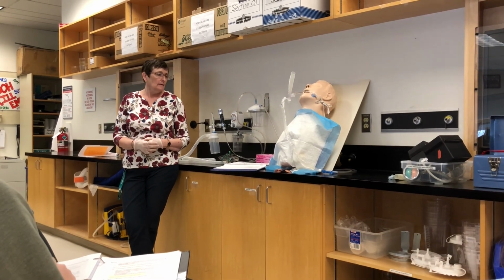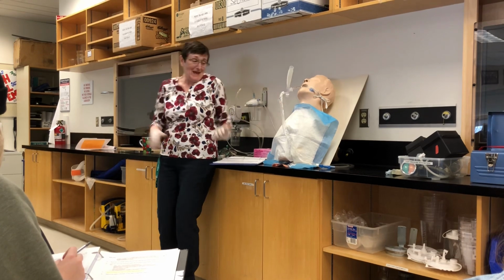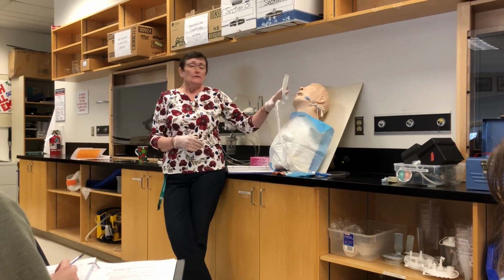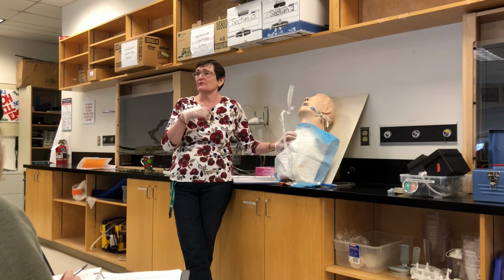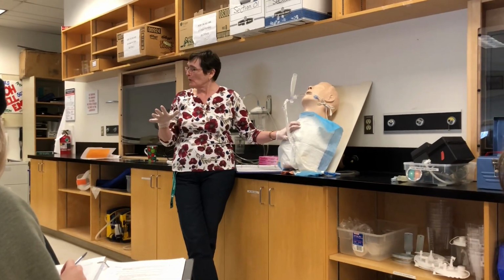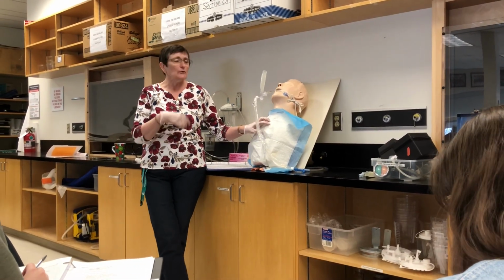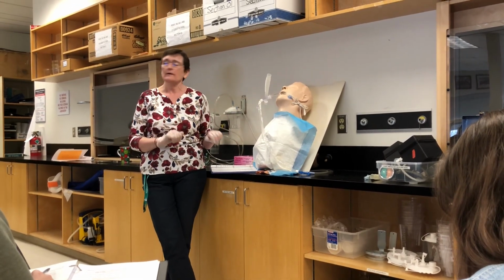Okay? Okay, Mr. Smith, we're going to take that tube out. He's going to go, yay! Thank you so much. Well, he won't say that yet, but he will when we're done. Okay? So we're going to tell him it's going to be a little bit uncomfortable when we take this tube out. Your throat's going to feel a little bit raw or a little bit sore. Don't worry, that will go away. And I'm going to get you to really cough when we get that tube out. Okay? So explain what you're going to do. Now I'm going to get my equipment ready. I'll be back in a second.